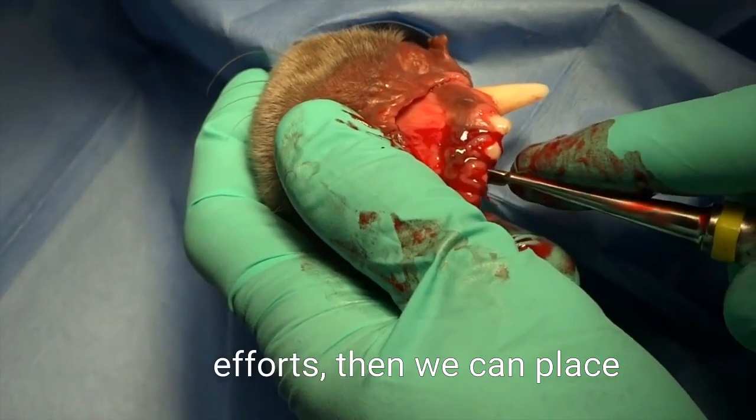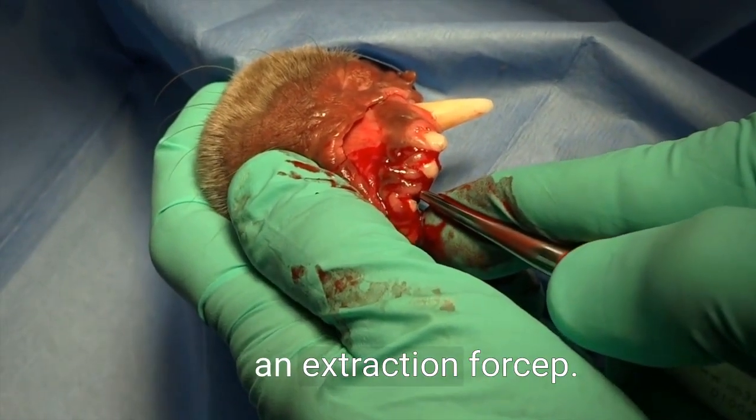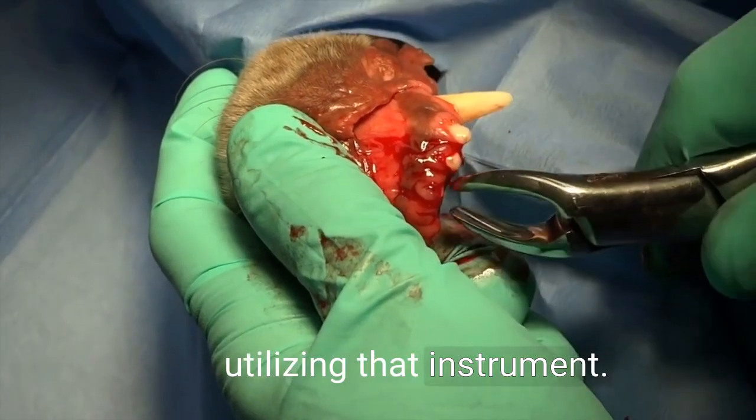Once we get to the point where we have significant mobility based on our luxation efforts, we can place an extraction forcep onto the crown and extract the teeth utilizing that instrument.